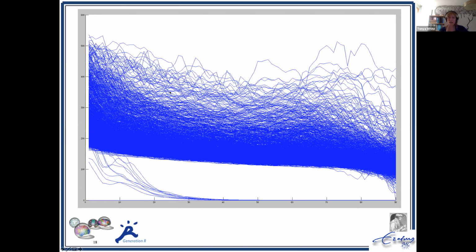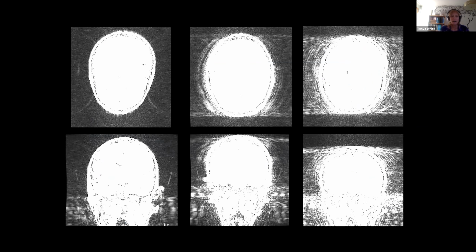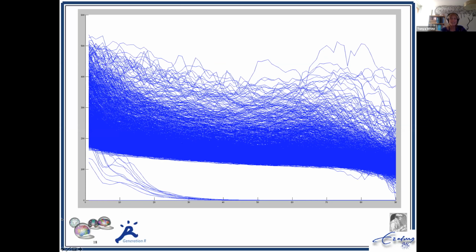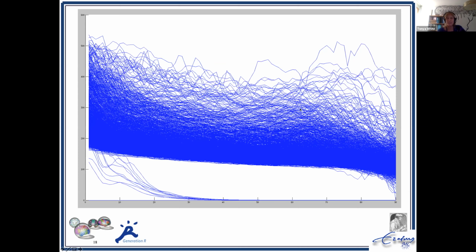So now I'm going to talk about how I'm thinking about this. So what's the axis here, Tanya? The X and Y axis? Oh, distance. Okay, so the Y-axis is signal intensity, and the X-axis is distance. I'm going to get into this in more detail, but I'll come back to your question because I think I'll explain it as I go.